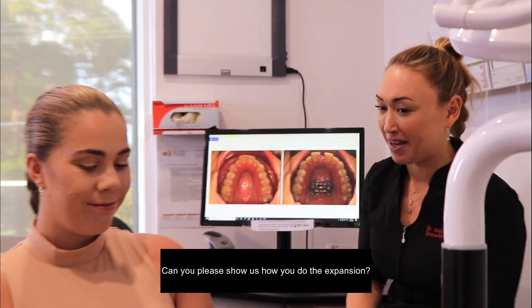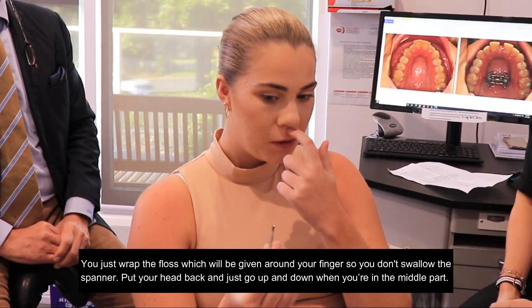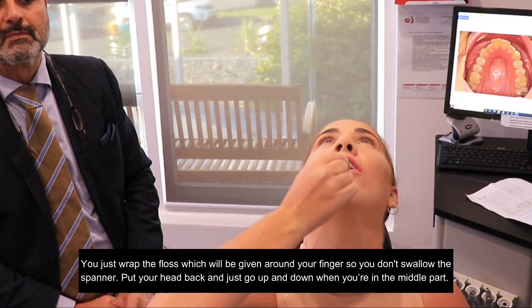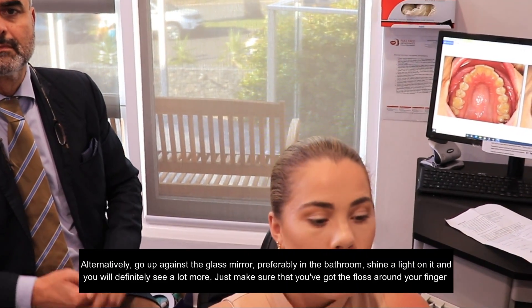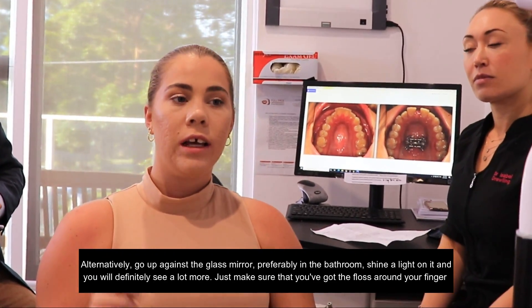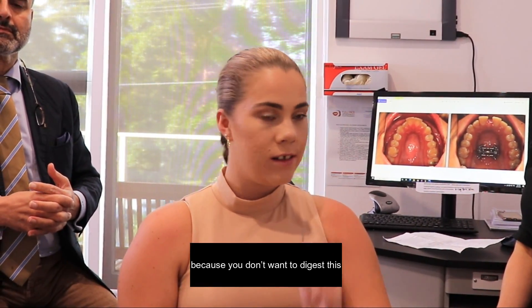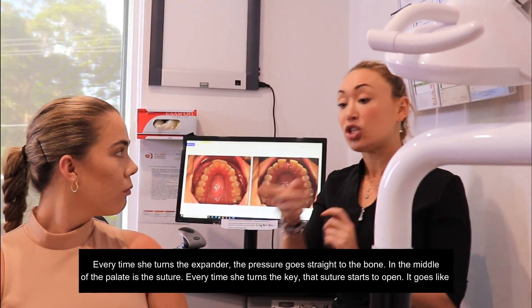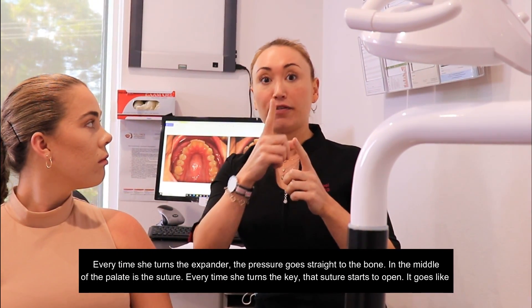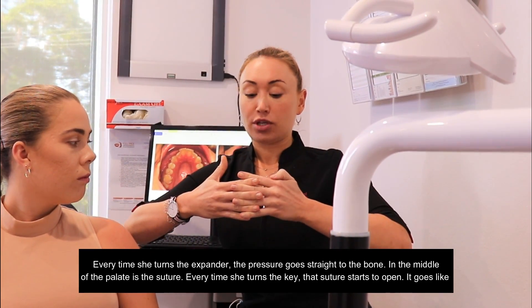Once the four TADs are inserted, I ask the patient to turn four times a day. Can you please show us how you do the expansion? You just wrap the floss — which you'll be given with the spanner — around your finger so you don't swallow or choke on it. Then put your head back and just go up and down. Every time she turns the expander, the pressure goes straight to the bone. In the middle of the palate there is a suture, and every time she turns the key, that suture starts to open.